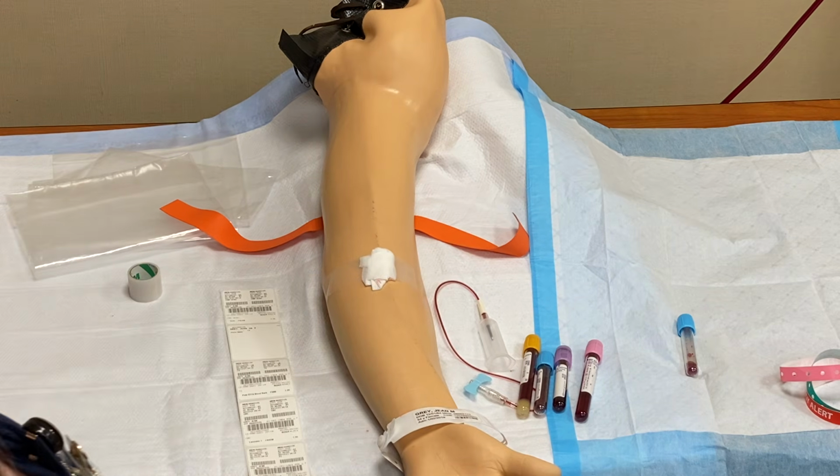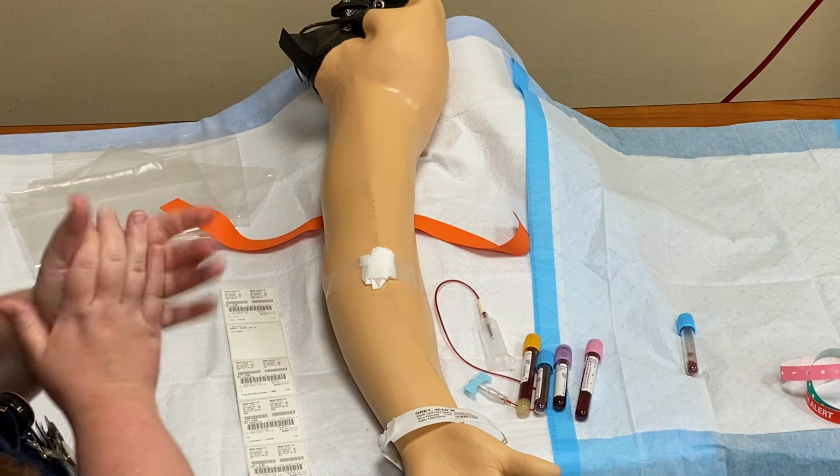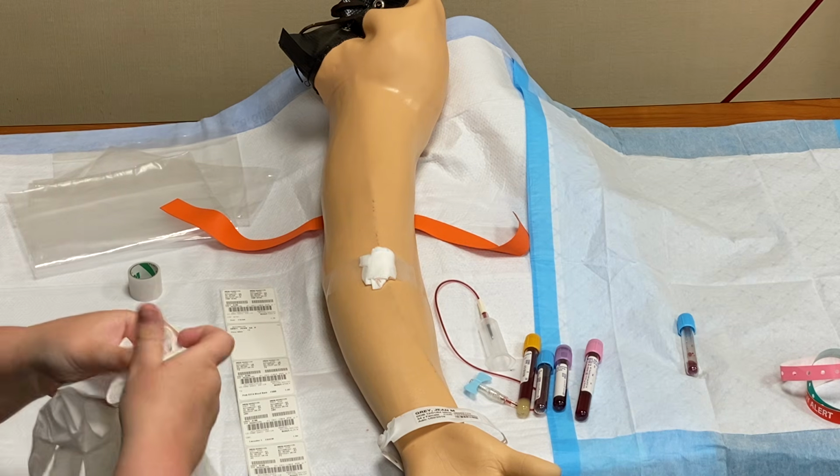Now I'm ready to label my tubes. Since my tubes have blood in them, I want to put my gloves back on. So I'll wash my hands, put my gloves on.